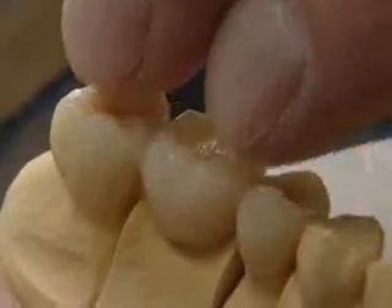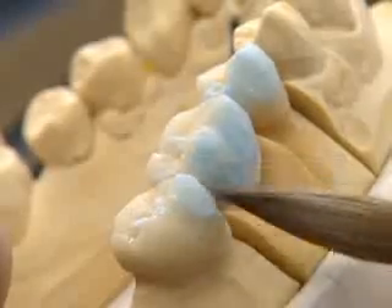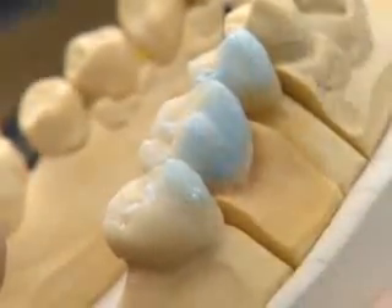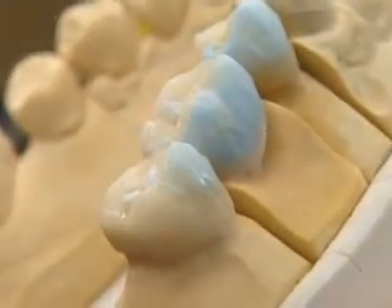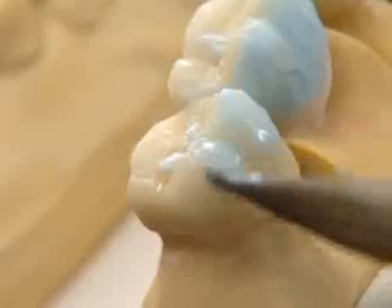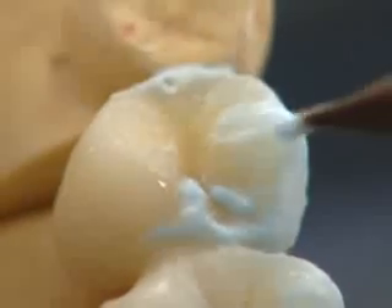Corrections with the second or third firing are predominantly carried out using enamels. Occlusal details are supplied and the morphology of the occlusal surface, according to the occlusion, is perfected.